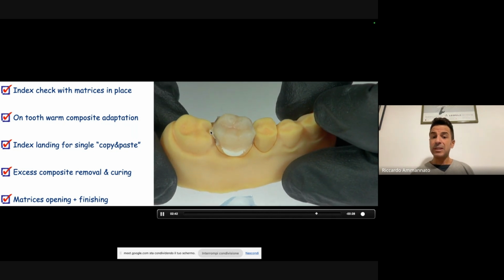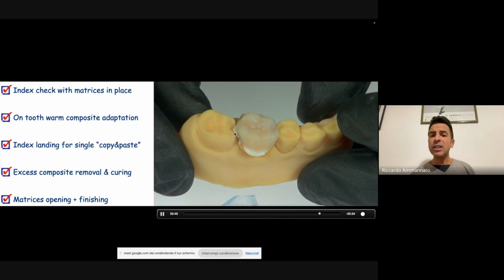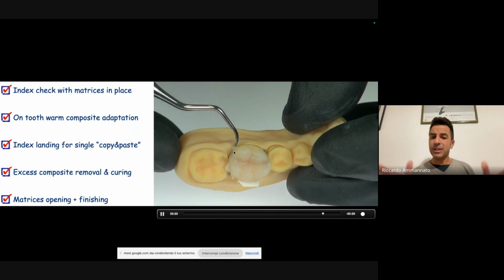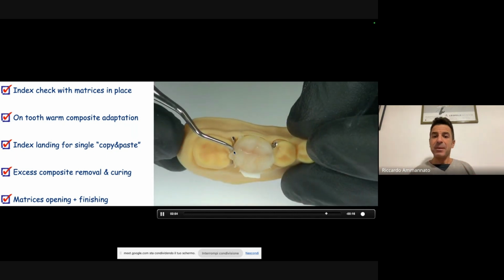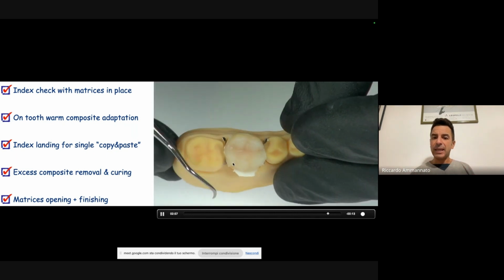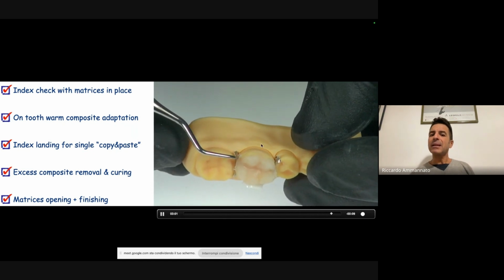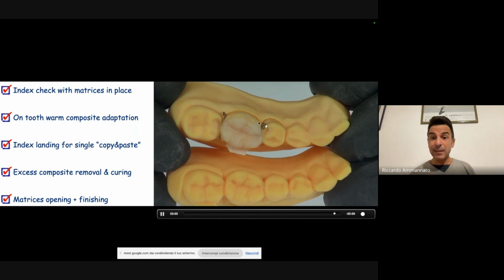I could have removed this before curing, but this with the scaler, I'm just going to break it with the scaler. I'm going to open up the matrices that were hugging my tooth while molding, and here you see you just break it, and the interproximal finishing that I need to perform is really minimal.